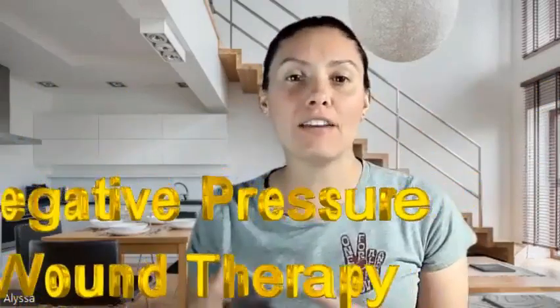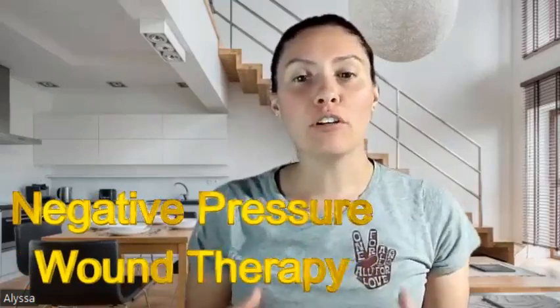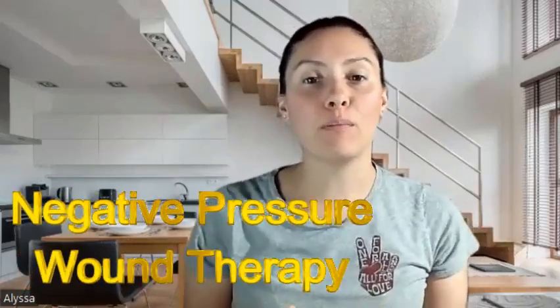So, vacuum assisted wound closure is a method of decreasing air pressure around a wound to assist in healing. It's also referred to as negative pressure wound therapy. During a VAC procedure, the healthcare professional applies a foam bandage over the wound and applies a pump to create negative pressure around the wound. This pressure is lower than the pressure in the atmosphere, which pulls the wound edges together.